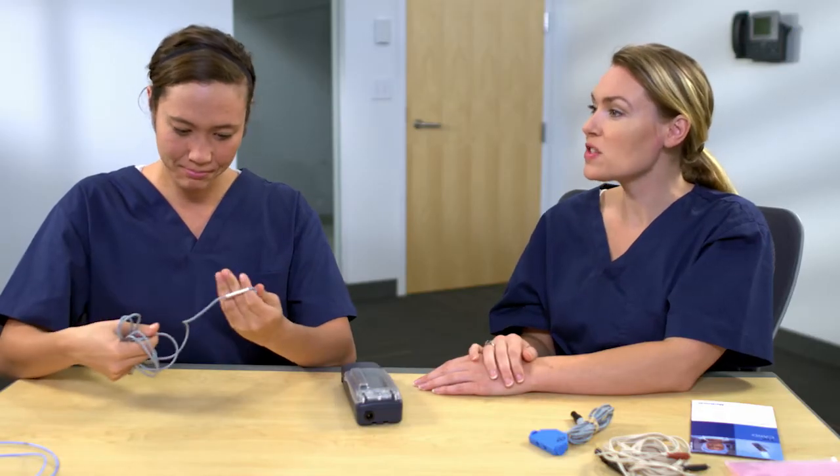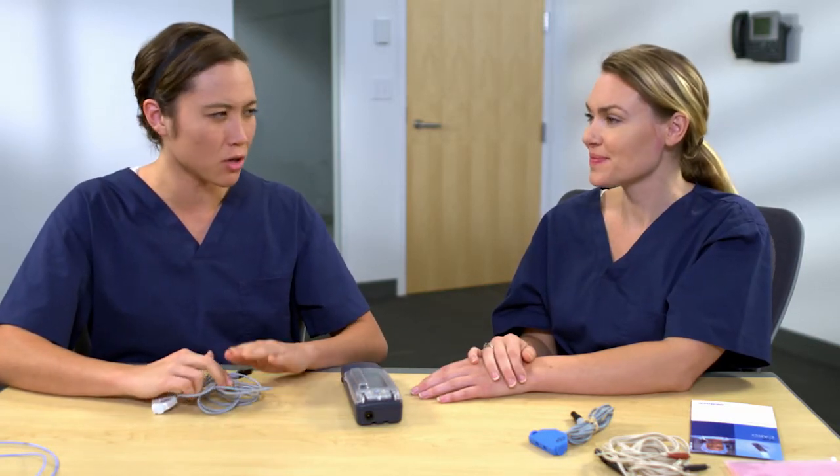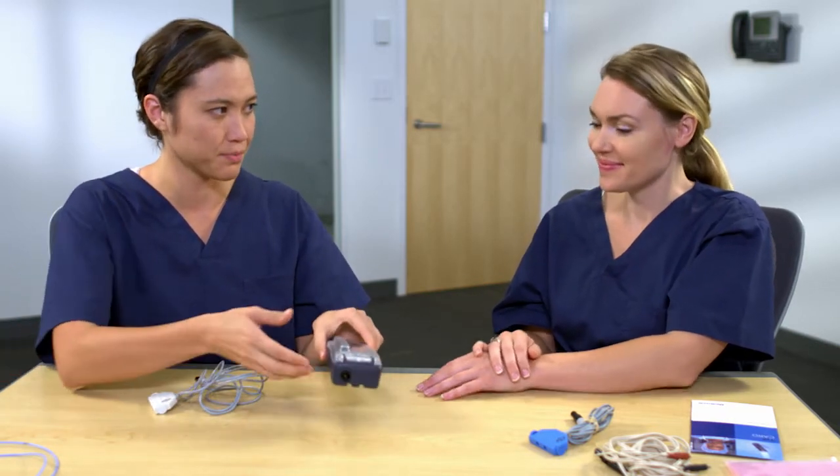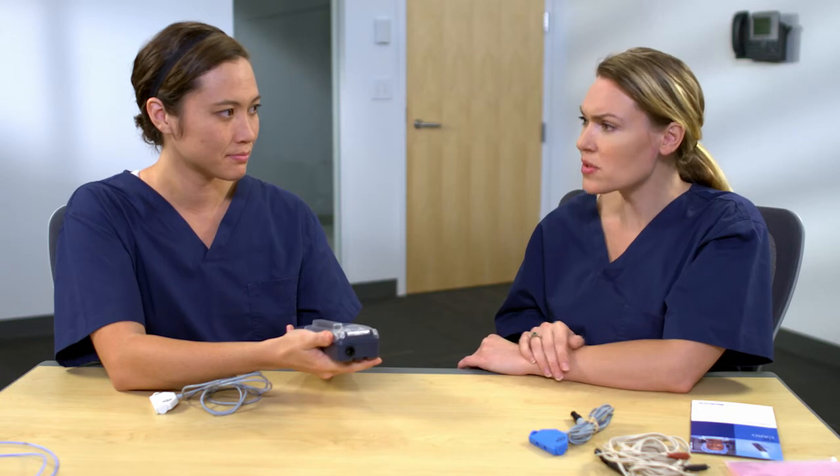Now that we've inspected the device and cables, we need to put in a new set of batteries. I recall these steps from our earlier discussion. It takes size LR6 or AA batteries. We should only use alkaline batteries and not use lithium or rechargeable ones. Yes, great job. And do you remember how to install them?